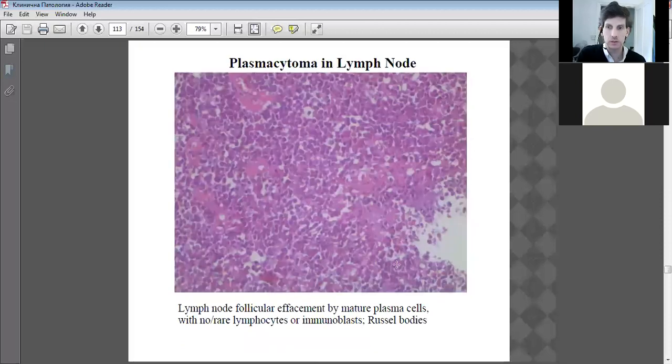So here we go. Some more examples. Plasma cells. Good examples of plasma cells in this high magnification. There's a good example of a plasma cell there. And if you look more closely, you can see more. There's another one there. Another one there. Tend to be the larger ones with a clearer cytoplasm.